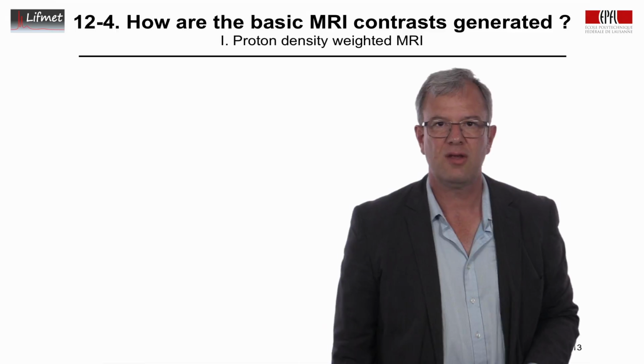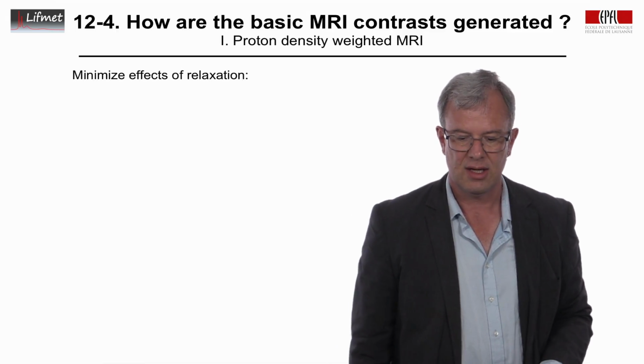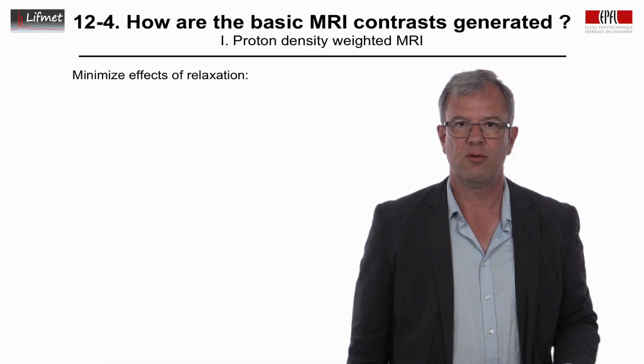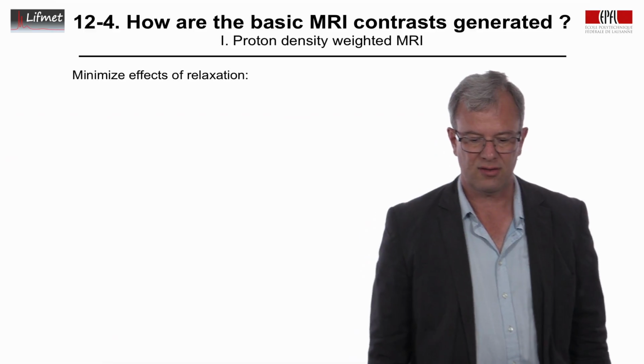So how are the basic MRI contrasts generated? We'll start out here with proton density weighted MRI. For proton density, one wants to minimize the effects of the relaxation.